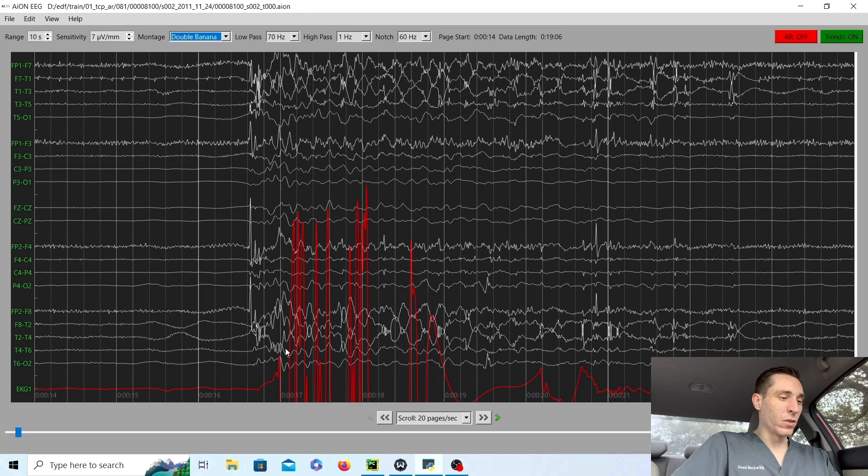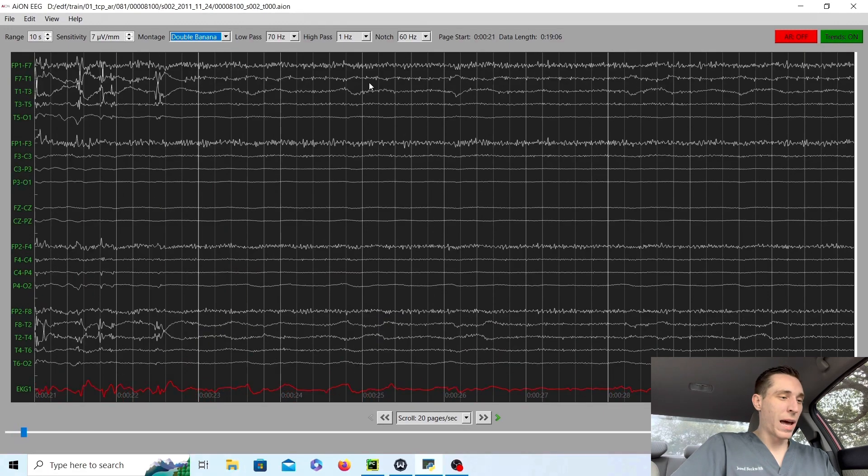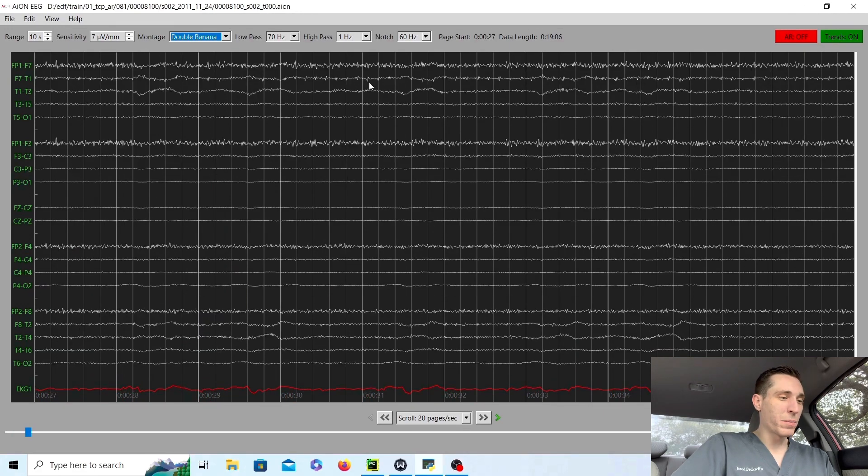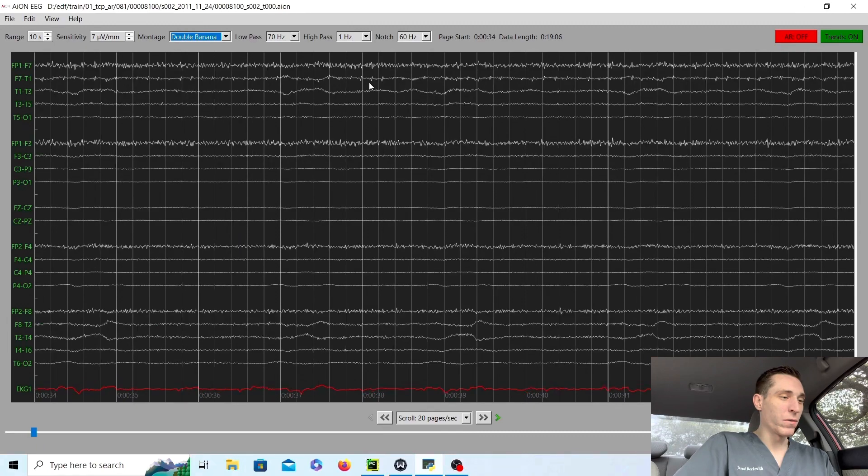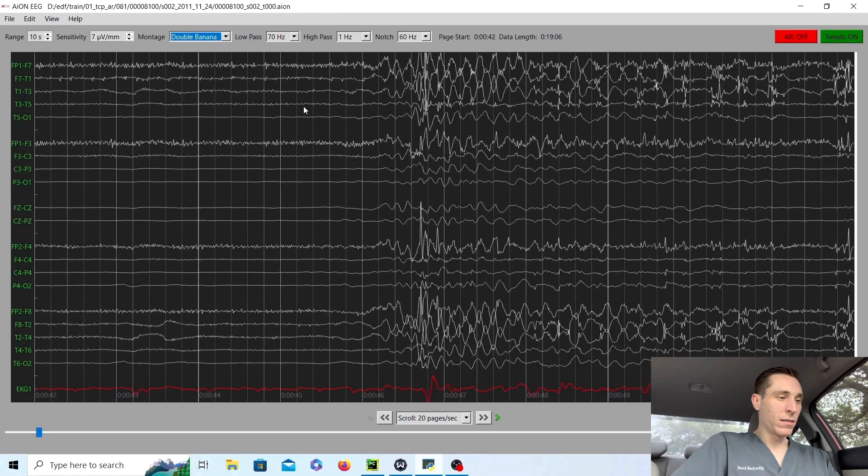But it's mostly just that suppressed flat pattern, and then you have a little burst of activity here. And then it goes back to the suppressed pattern, the almost flat with a little bit of muscle, and a burst again.